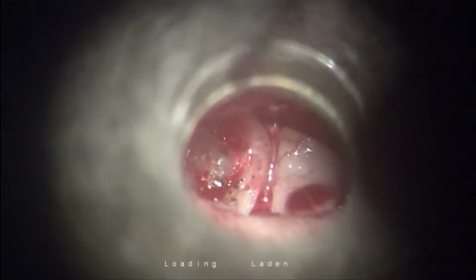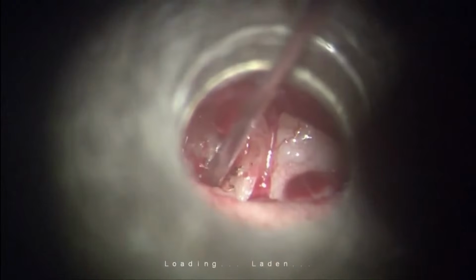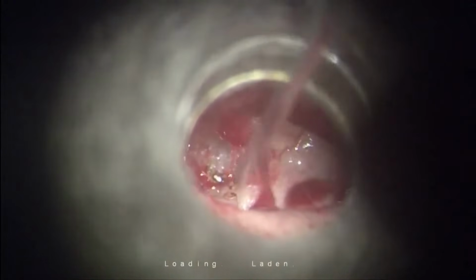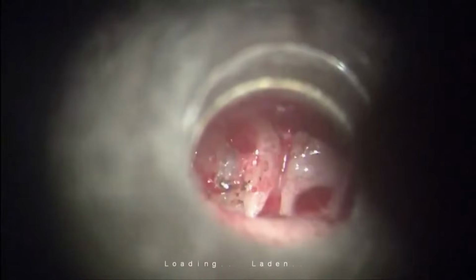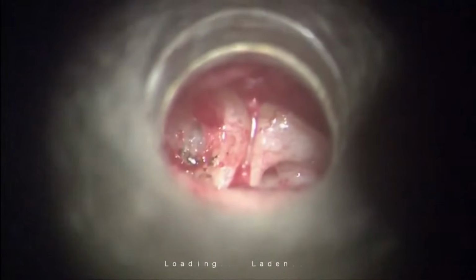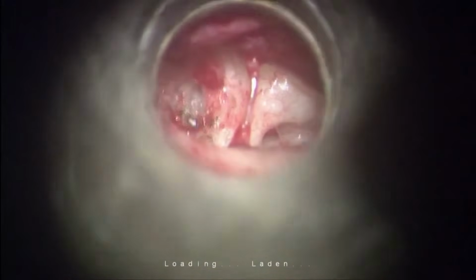And now we have the footplate in view. Can you see? Yes, sir. The superior part of the footplate is thick, but inferiorly, in the central part where we have to make the fenestra, it is very good. Can you see very clearly? Yes, sir.